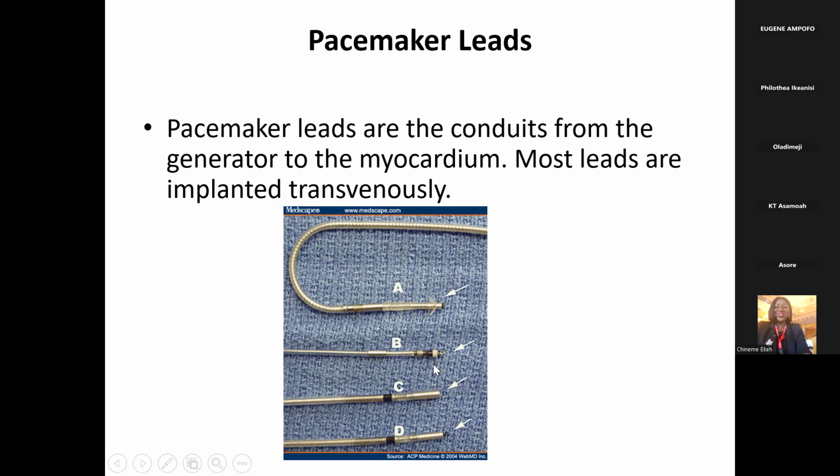By the time fibrous tissue is formed, it usually takes 4 to 6 weeks for proper fibrosis to form. Then the fibrotic tissue will not be as hard as when you were not using drug coating around the tip of the electrodes. So it has been favored that each of the tips of the electrodes should have drug coating so as to prevent early formation of fibrosis and increasing voltages for the myocardium, which can drain the battery faster.